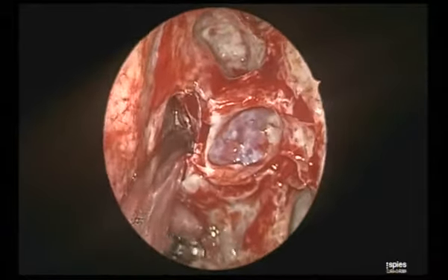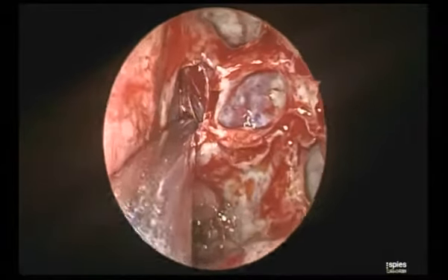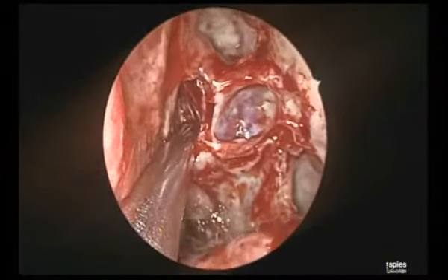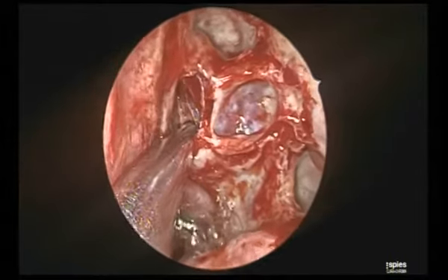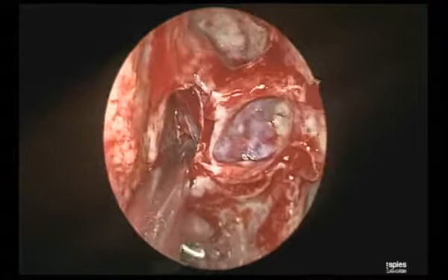So this is very important, I think. This is again something which Satish has brought into this FESS surgery, is the limit. How to be very safe about the posterior ethmoid. So identify the sphenoid ostium, identify the anterior wall of the sphenoid, and then carry on. See what I am doing at this point.